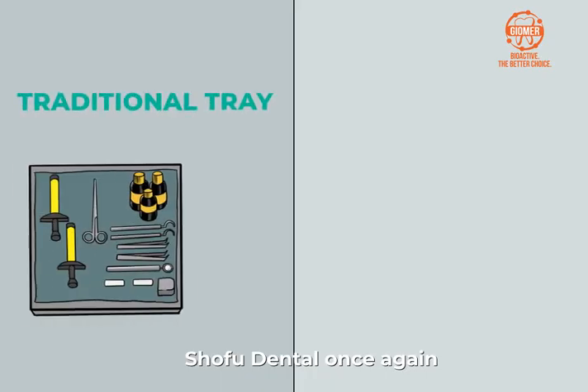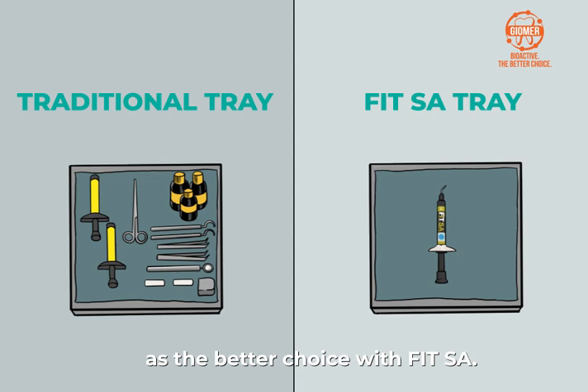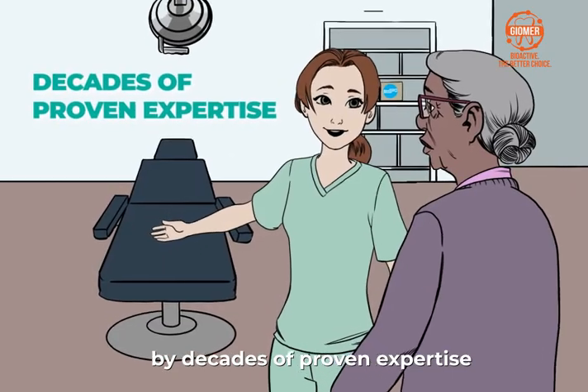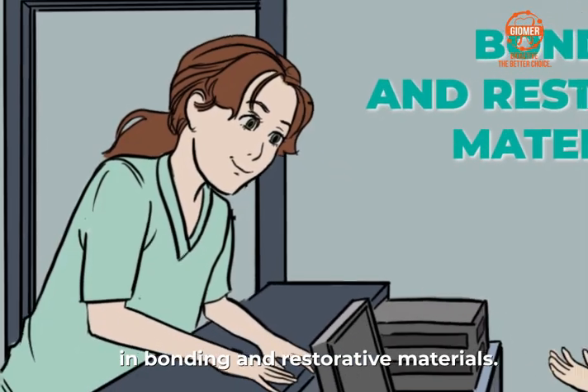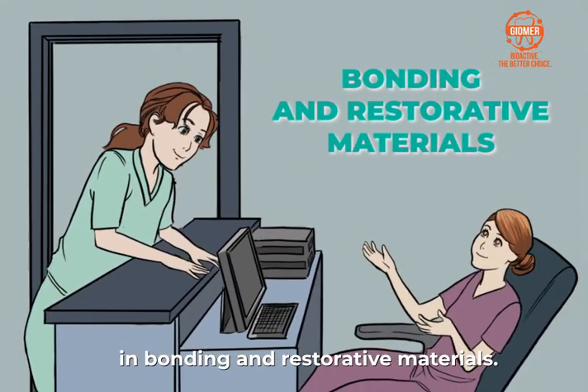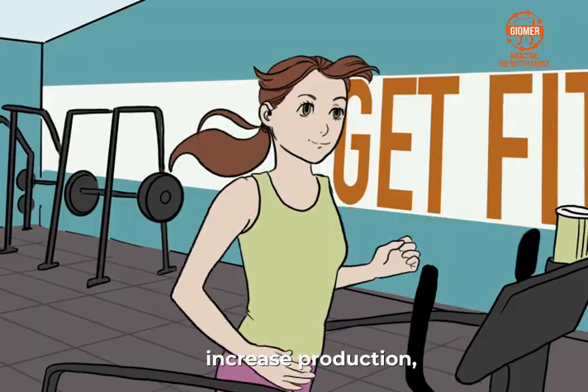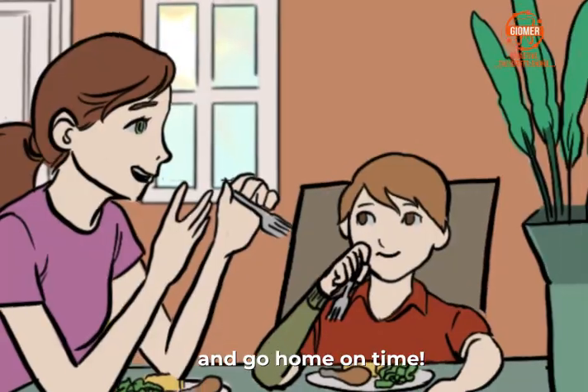Shofu Dental once again sets the standard as the better choice with FIT-SA. This technological advancement is brought about by decades of proven expertise in bonding and restorative materials. Choose FIT-SA as your better choice to serve patients, increase production, and go home on time.